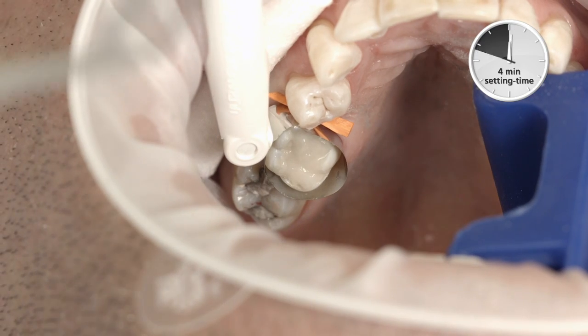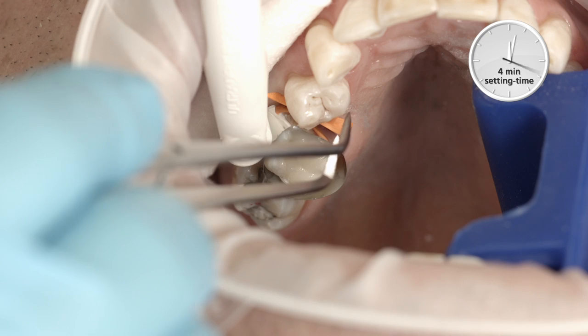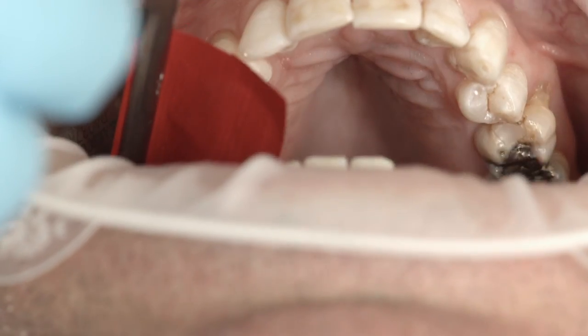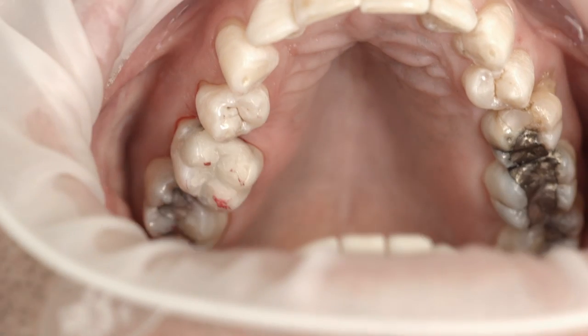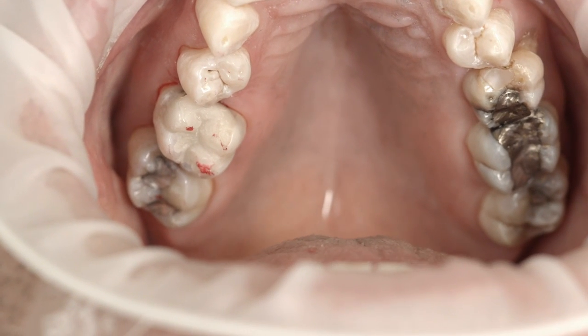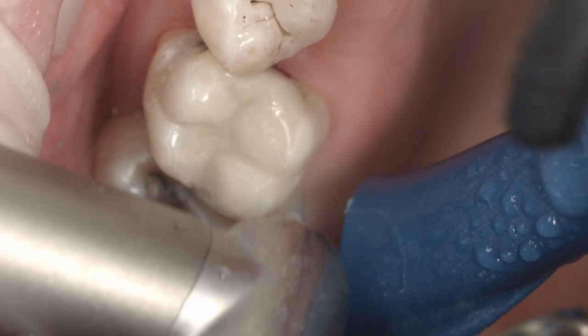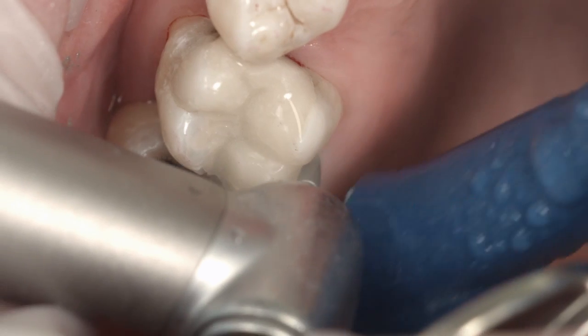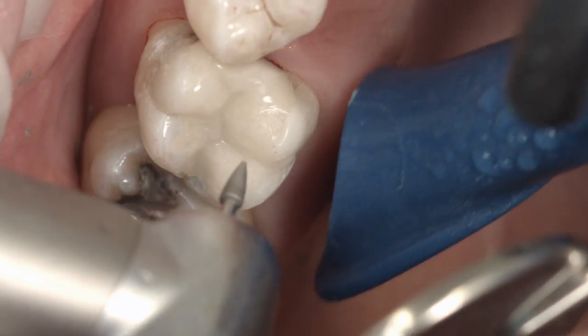Once the setting time of 4 minutes for the self-curing mode is reached, remove the matrix and wooden wedges. Check the occlusion and adjust as necessary.